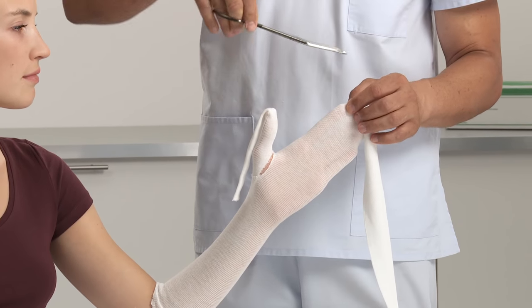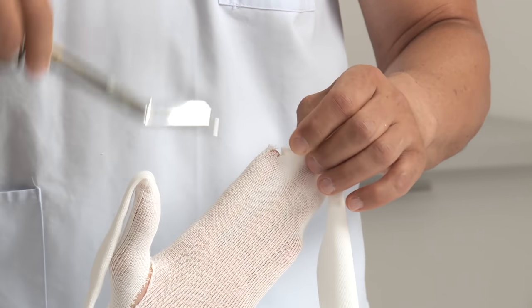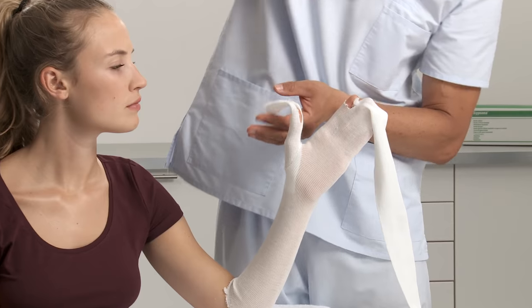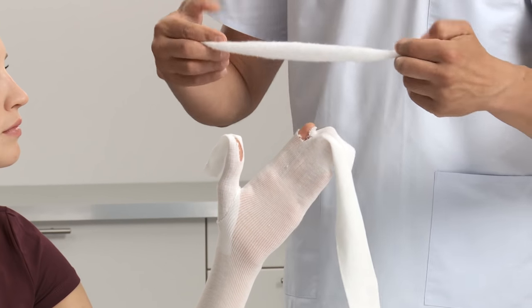Make a small cut close to the distal side of the index finger. Cut the thumb stockinette about halfway down the thumb. Use additional padding to cover any bony prominences.